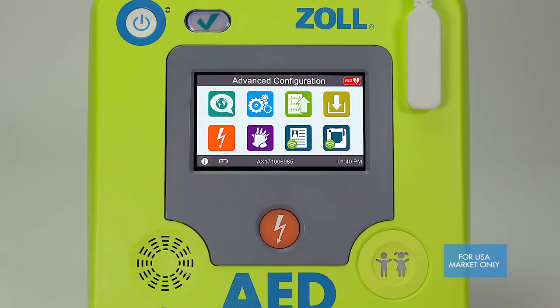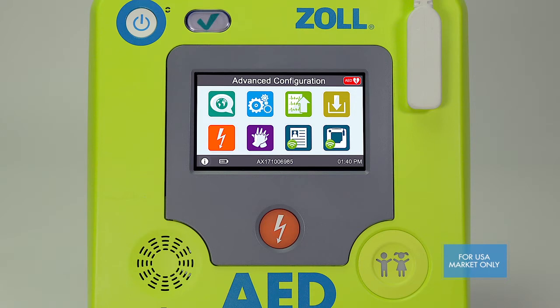The orange shock icon allows you to select the energy setting for the first, second, and third shock for both adult and pediatric patients. This allows you to set the shock energy based on your specific protocols. This feature is for medically trained, more advanced users and it's recommended that you do not change the factory default settings unless you're qualified to do so.